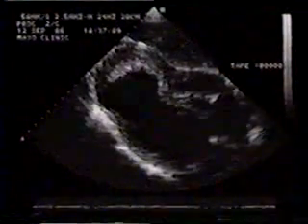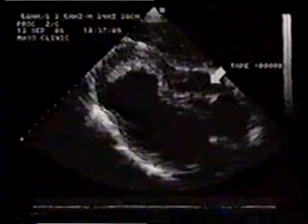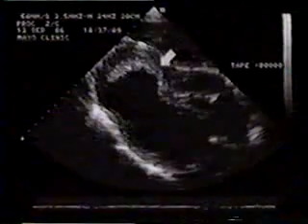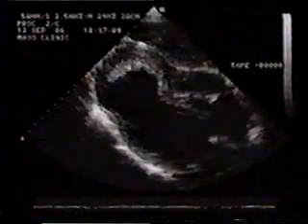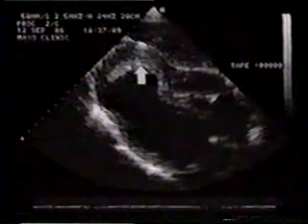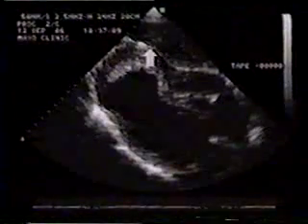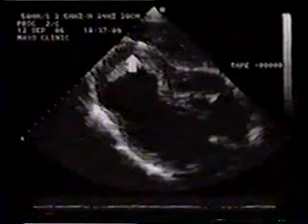On subcostal examination, the RV is compressed. This has the appearance of pericardial fluid, and it merges with the large thrombus accumulation which overlies the apex. You can identify the apical myocardium here. It has a slightly greater density than the thrombus. This is parietal pericardium. Therefore, this is pericardial hematoma, which is the result of rupture of the LV apical aneurysm.